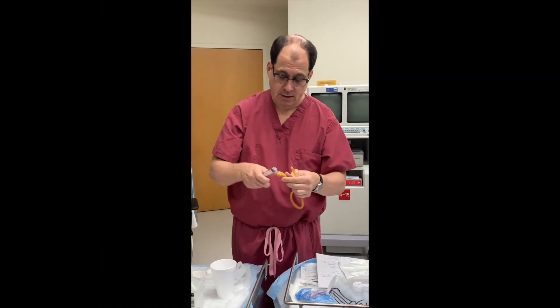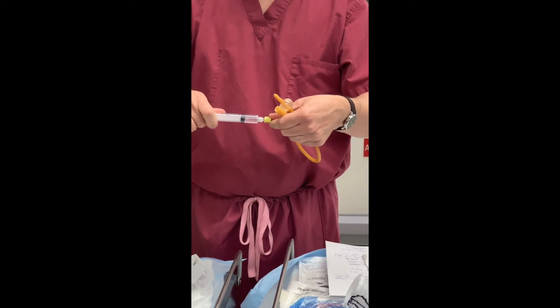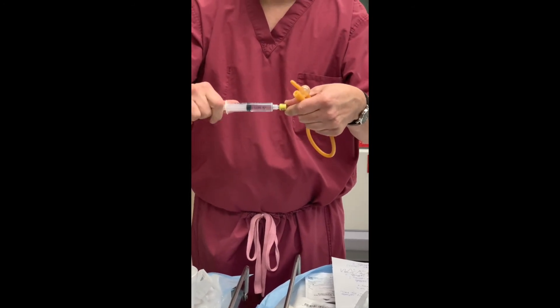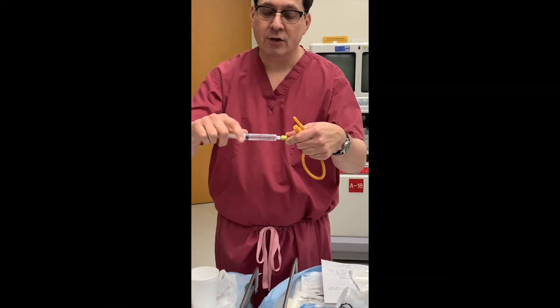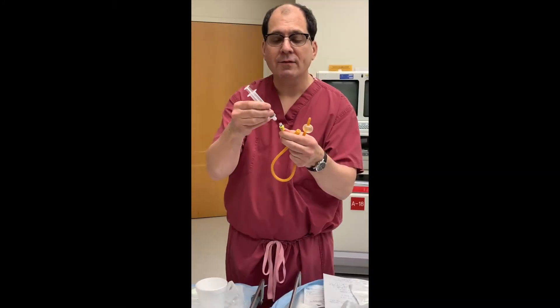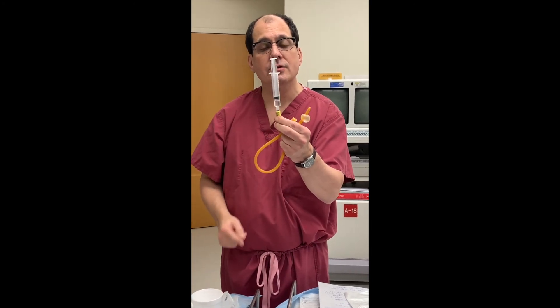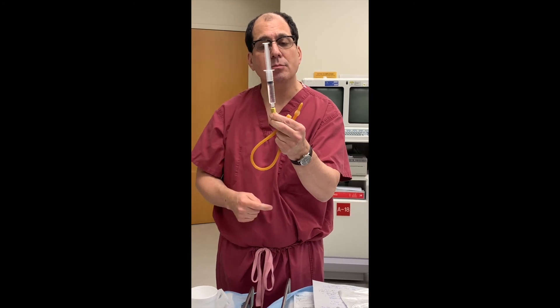Let me show you what it looks like to deflate the balloon. I'll disconnect and pull back. Another option: you don't have to draw back — just push the syringe together and wait 5 to 10 seconds. You'll see the plunger come back on its own.